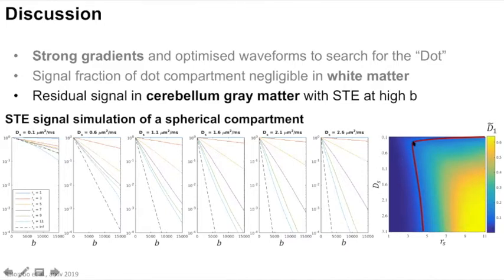So it might be that the signal comes from inside the cells with a much lower diffusivity, or it might be from outside cells that are very densely packed. So also the extracellular space actually becomes very restricted, or maybe a signal from within these dendritic spines.